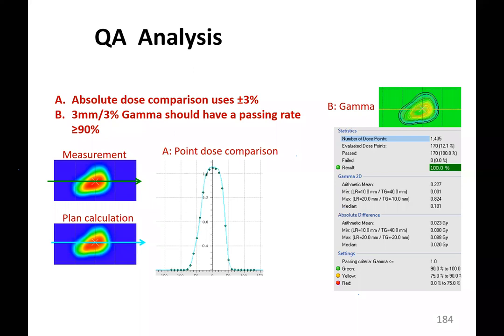Only we are having issues with the lateral edges, right? That can be handled very well by changing the Bragg peak energy in order to cover those lateral edges as well. So that's why we don't need that amount of expansion around the GTV as we do in the conventional treatment. For hypofractionation, you see the margin is also reduced. And even now with the IGRT, the margin is not what it used to be for the 3D CRT.